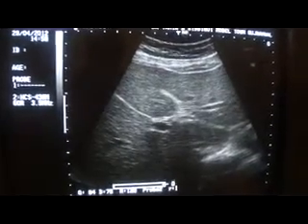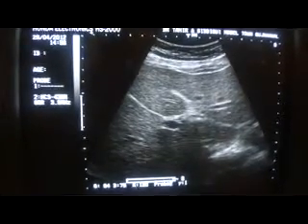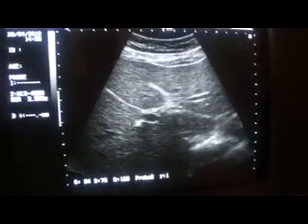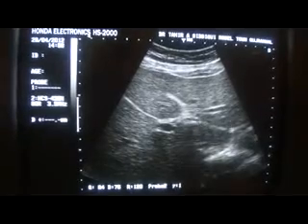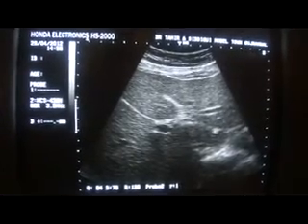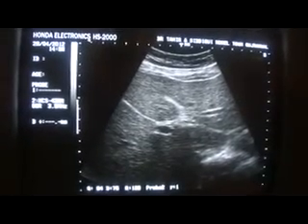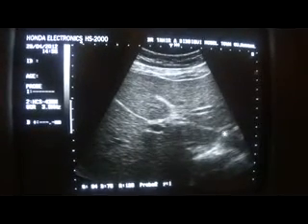So one, two, three. This is the transverse section. I placed the probe transversely then angled it towards the patient's sub-costal region, moved it towards the patient's left sub-costal region, then the right sub-costal region, and angled it towards the patient's right shoulder. This is the left lobe of the liver in transverse section.